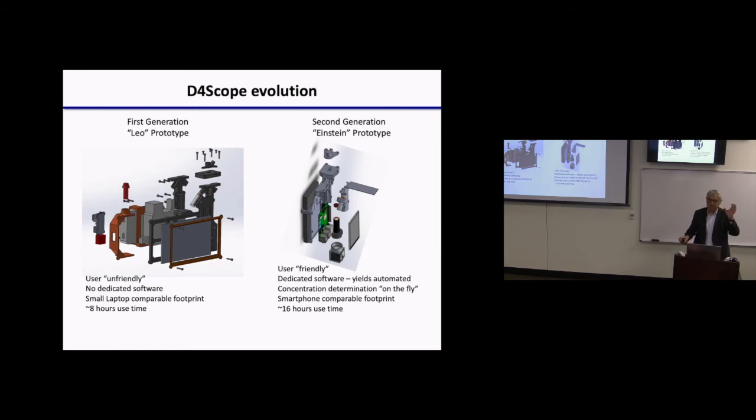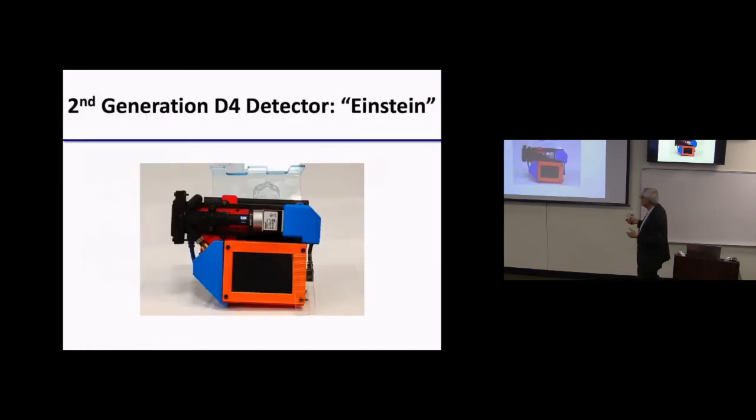And it'll show up on the screen. It'll show the spots, it'll show the concentration, and this is Wi-Fi compatible, you can send it to a server. So everything can be sent to a server and stored. And it's going to be RedCap compatible because we have to go to China or Guatemala to do some access. So this is what it looks like. It's about this big. It weighs a few pounds. It costs us about $750.